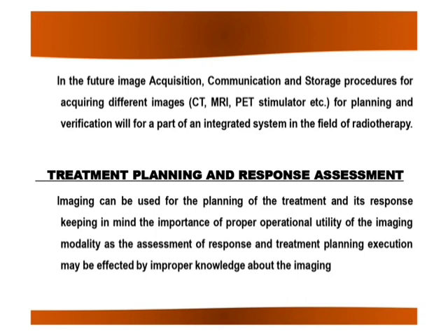So for image guided radiotherapy or SBRT, you require fiducial markers, and these markers are implanted with needles into the tumor area or around the tumor, so that you can image them during interfractional or intrafractional movements of a tumor, and allow the margin according to that.